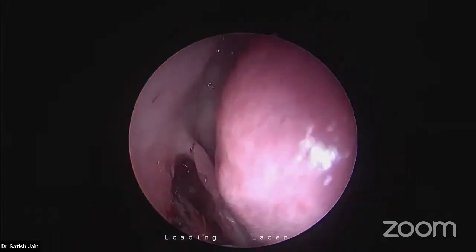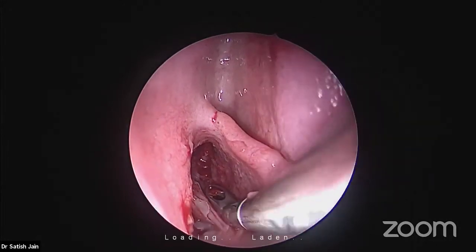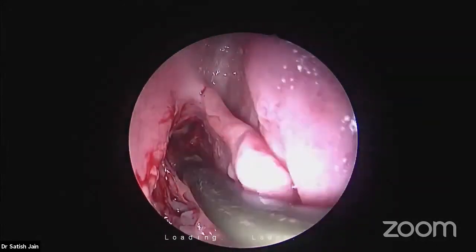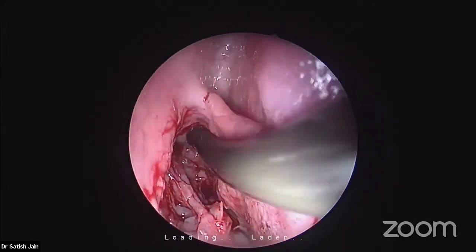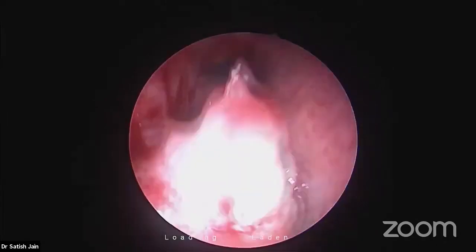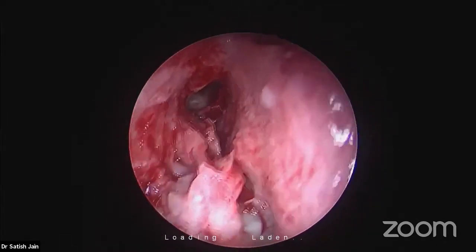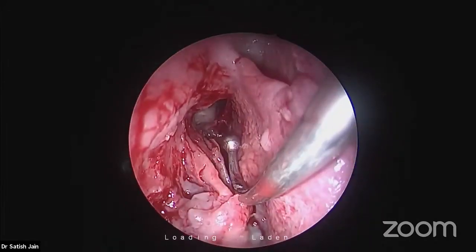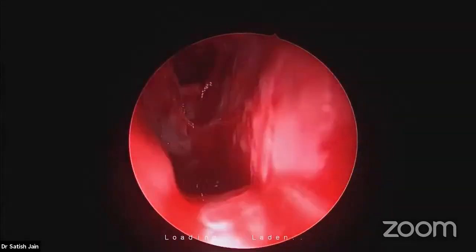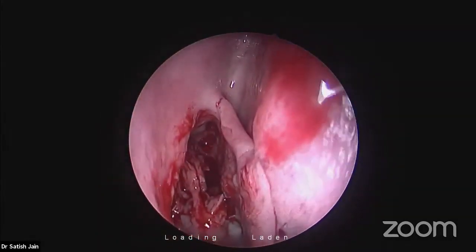Any difference between suprabullar cell and suprabullar recess? Suprabullar cell and recess are the same thing. No difference in it. Now, why do people call it a recess? Let me tell you. I fractured the bulla to show you the anterior ethmoidal artery. I'll come to your point, sir, again. I fractured this bulla to show that the anterior ethmoidal artery is behind. Let me clear that region to show you first.